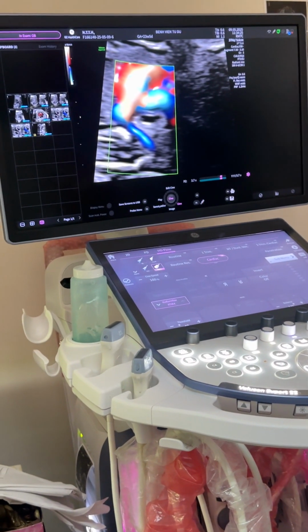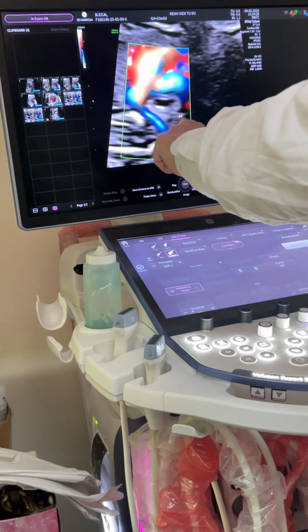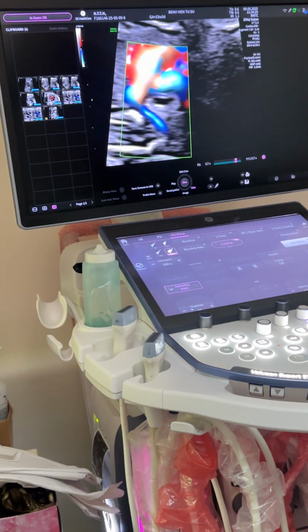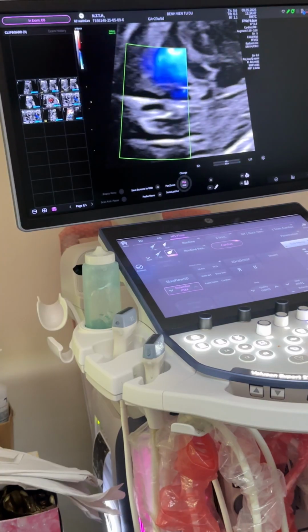But you say, Simon, this could be the azygos vein. And I say, yes, it could be the azygos vein, which comes down and then looks like it drains into the SVC. So you need to see it going all the way out to the arm. I think this is going to be difficult in this patient at 23 weeks of gestation. Anyhow, you save that image.